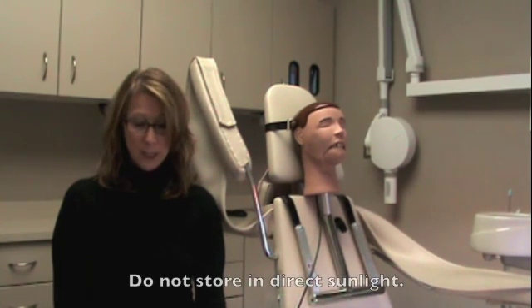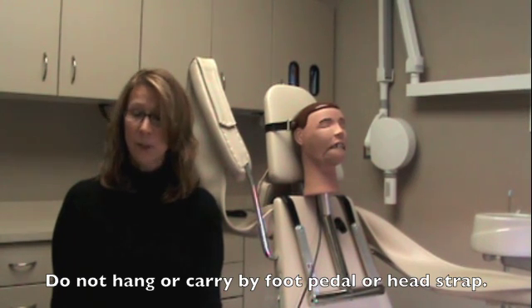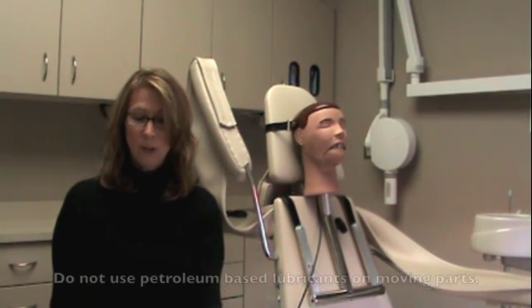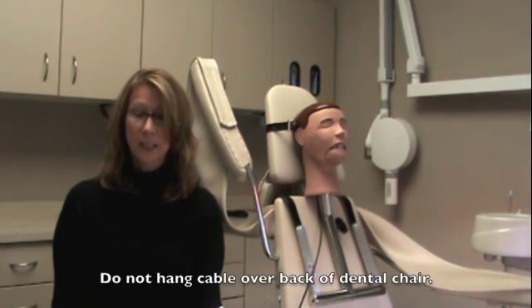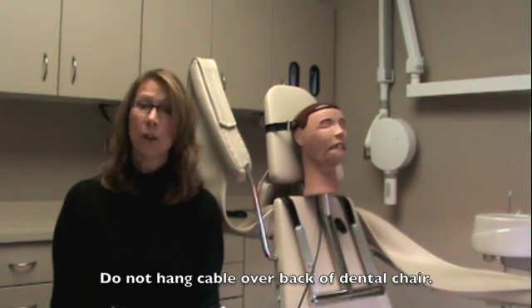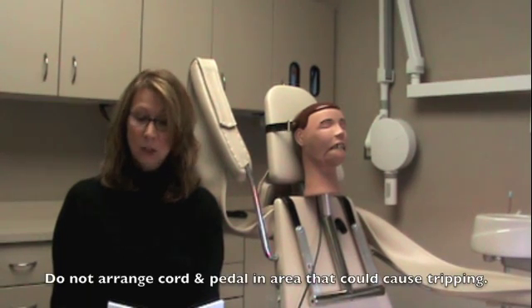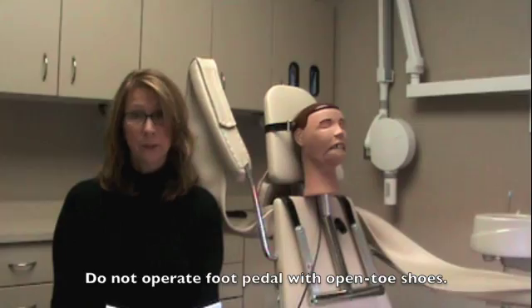Do not store your Dexter in direct sunlight. Do not hang your Dexter by the foot pedal or head straps. Do not use petroleum-based lubricants on moving parts. Do not hang the cable over the back of the dental chair, as this could cause kinking or damage your foot pedal. Do not arrange cord and foot pedal in an area that could cause tripping. Do not operate the foot pedal with open-toed shoes.